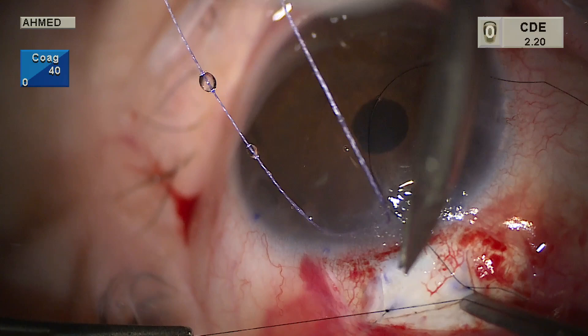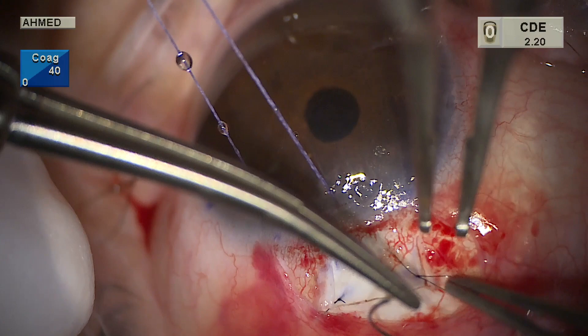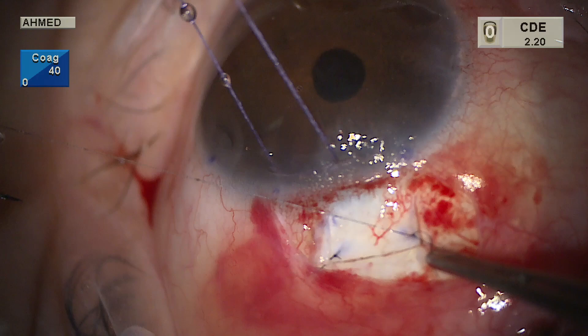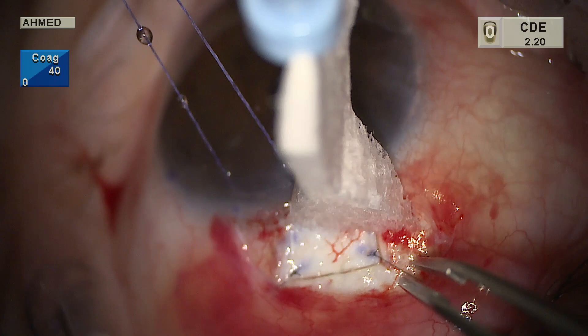The nylon suture is then locked in place with a single throw in the reverse direction on both sides, and the knots are trimmed nice and short. We like to bury these sutures into sclera to prevent erosion through the conjunctiva. The knots can be rotated into the flap or rotated posteriorly, but it is important to ensure they are not left on the surface of the sclera.